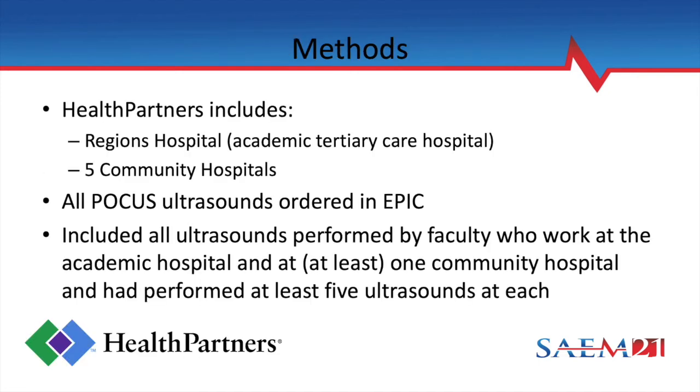The methods, basically, I work at Health Partners, which is a healthcare delivery system that includes an academic tertiary care hospital and 5 community hospitals. All point-of-care ultrasounds are ordered through Epic, and so it's very easy to track these.